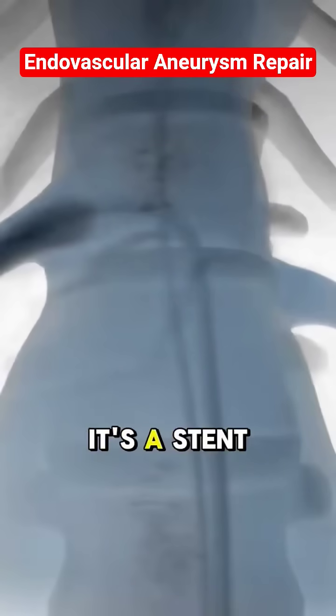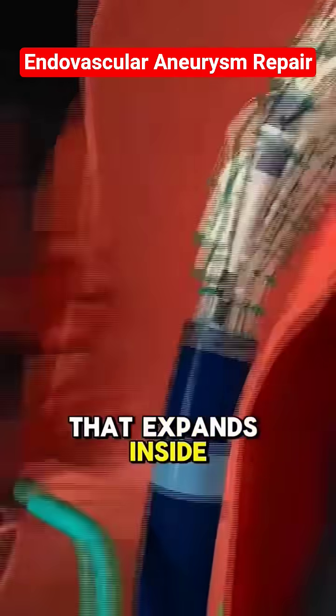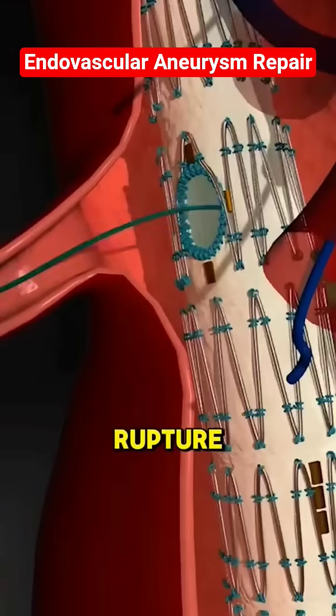That device? It's a stent graft — a fabric-covered metal mesh that expands inside the aneurysm and creates a new pathway for blood. This reduces pressure on the aneurysm wall and helps prevent rupture.